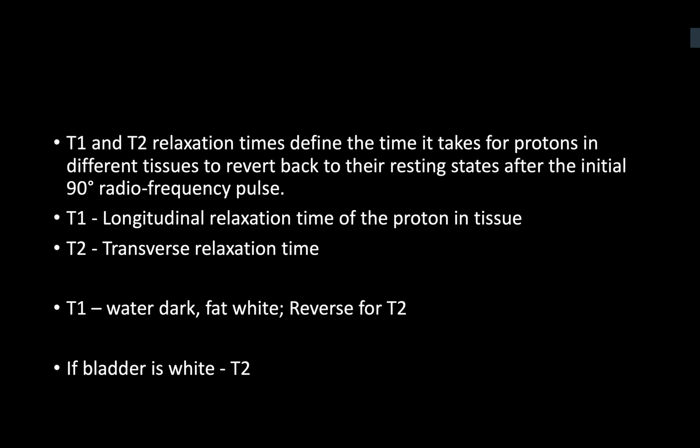Okay, well done. So, what is meant by this T1 and T2? So T1 is when the hydrogen flips back to a longitudinal orientation. Well done. And T2 is loss of precessional coherence. Exactly. So it all depends on the relaxation time of the proton. So if it relaxes back into its longitudinal direction, it is T1, and back into the normal or transverse direction is T2. How does it help?